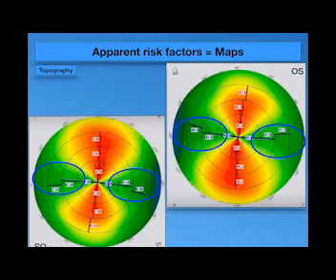Finally, to summarize this slide, look at the topography. If there is a normal, regular, acute bow tie, like shown in these figures, you will find in the normal spherical cornea that the superior point is like the inferior points in the central map. But if there is a difference between both, it may be related to the conical, non-smooth surface of the cornea.